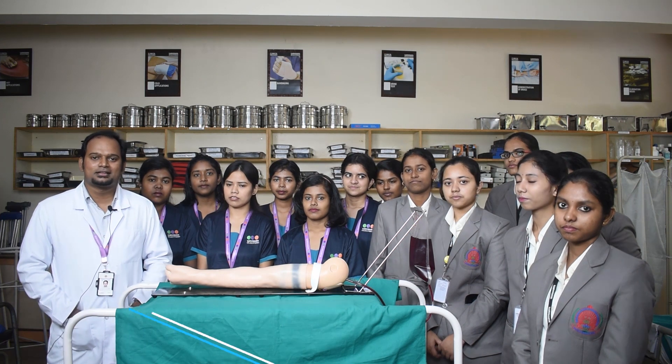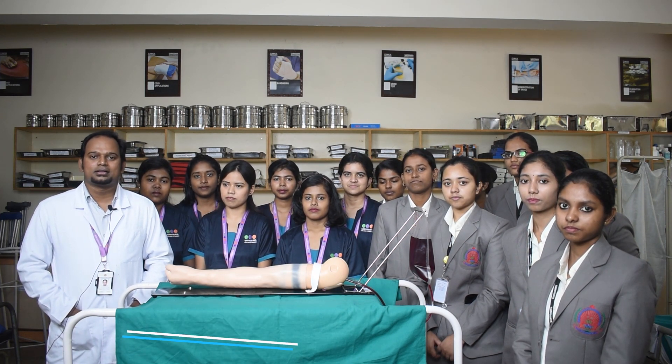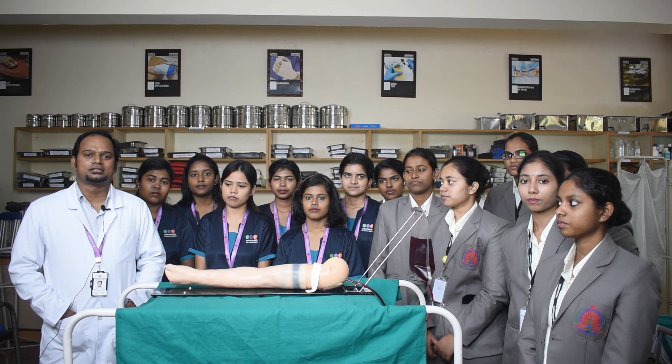Hi everyone, this is Anand Isak, working as assistant professor in Sarvodhia College of Nursing. I would like to demonstrate the IV cannulation procedure to first-year and second-year nursing students.